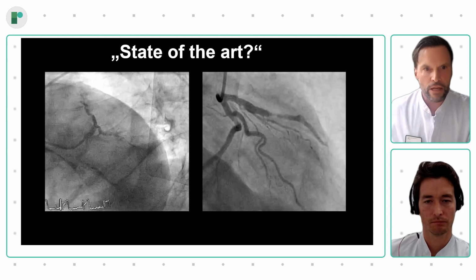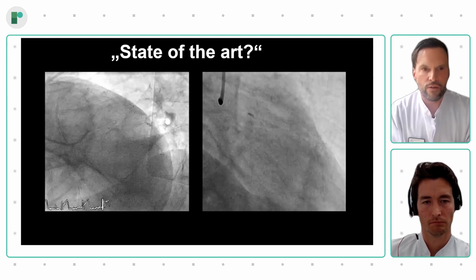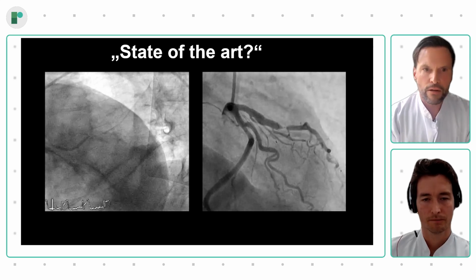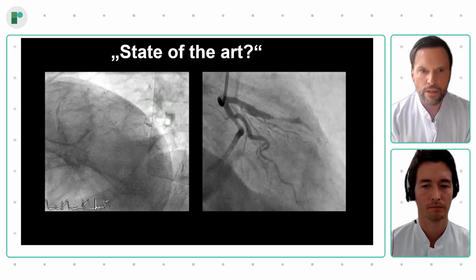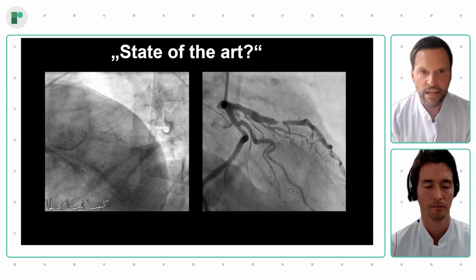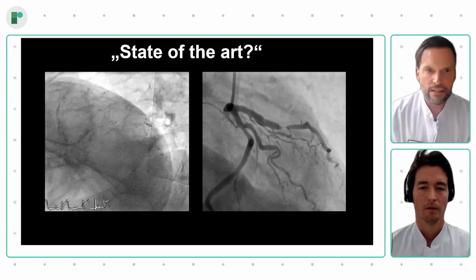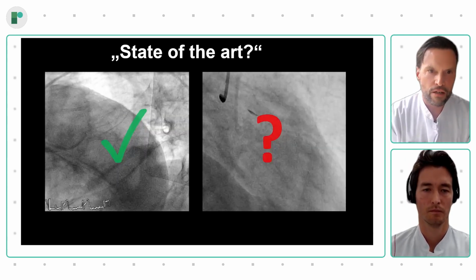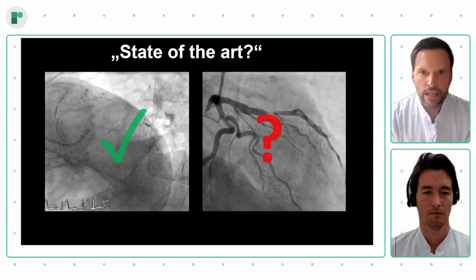So this is when I want to hand over to Alexander, because if we now go into more detail concerning the guidance from the EuroPCI and so on, I think it's clear that IVUS should be used in complex situations.